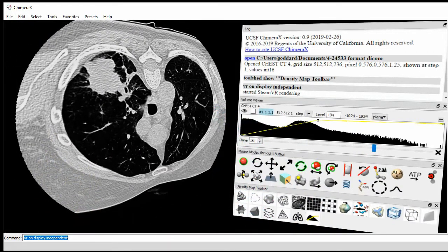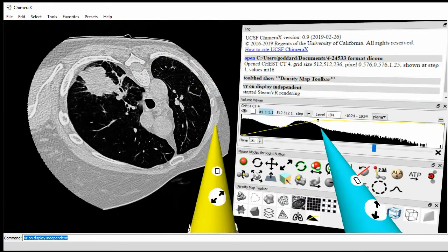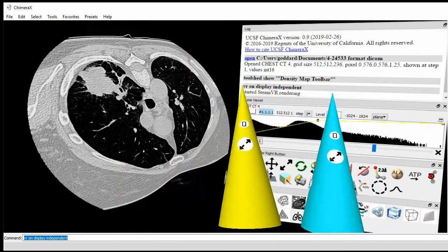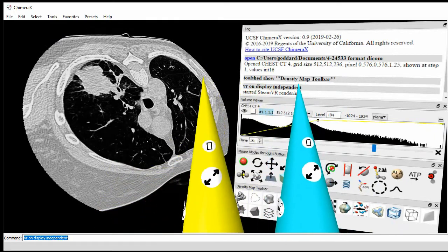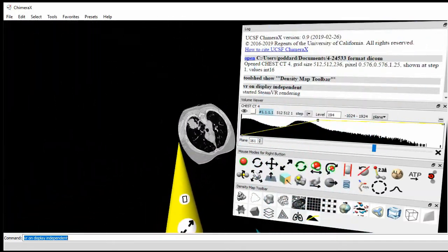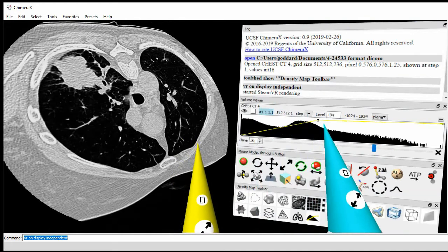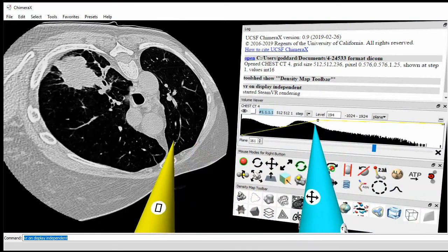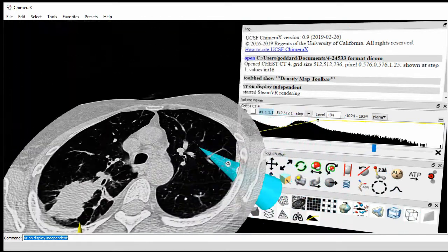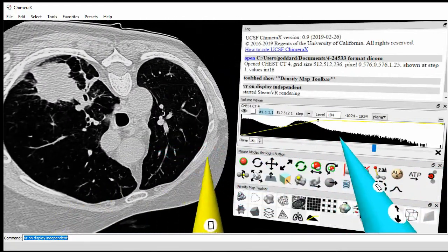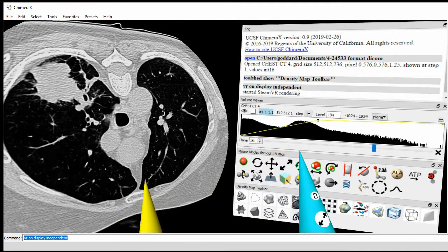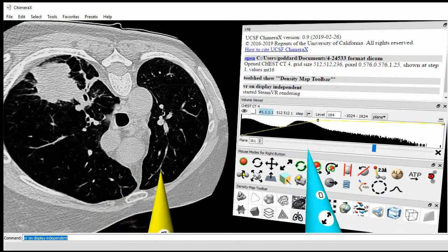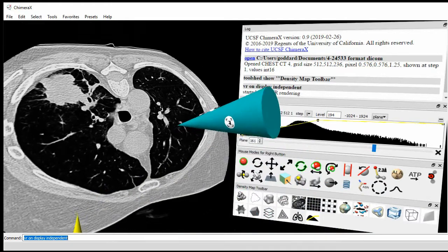Let's first just slice through these planes. Actually, first let me show you what the hand controller buttons do by default. On the top, the two little arrows, this is zooming. If I click the button and I move up and down, that will scale the size of the data. The trigger button on the bottom has a little cross, a little plus sign icon, allows me to move the data so I can rotate it or move it to any position. There's a button on the side that re-centers the data. We're not going to need that. And I already showed you bringing up this menu, this panel with the little rectangle button.